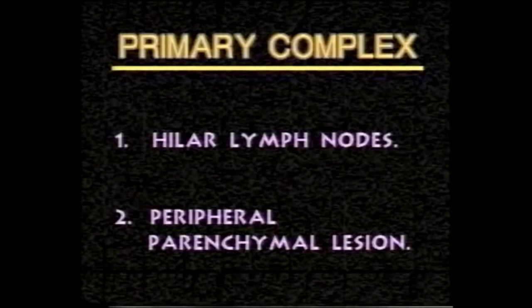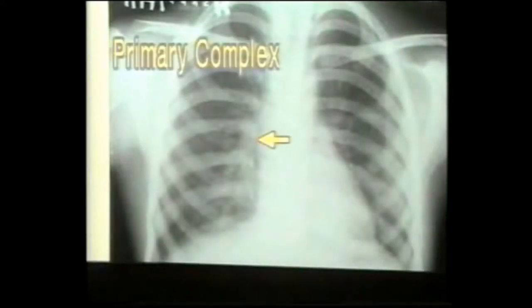Primary complex is a primary tuberculosis infection seen in children. Radiologically it shows two components: a peripheral parenchymal lesion and enlarged hilar lymph nodes. This is an X-ray of a primary complex — note the increased density in the hilar region. These are hilar lymph nodes seen as well-defined nodular dense radio-opacities in the region of the hilum, in line with the parenchymal lesion. The blue arrow shows the parenchymal infiltration in the lower lobe.